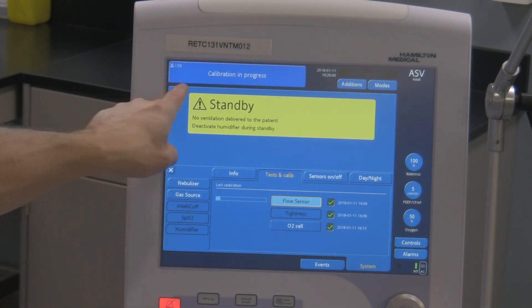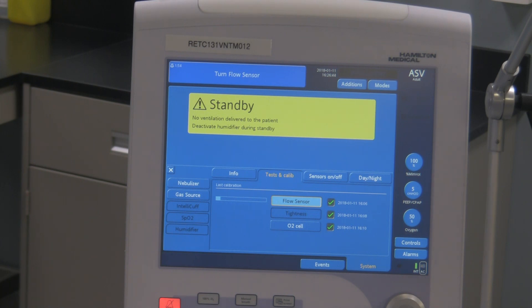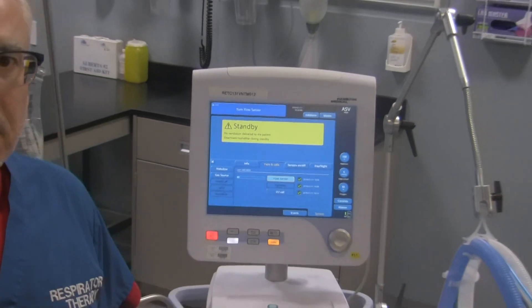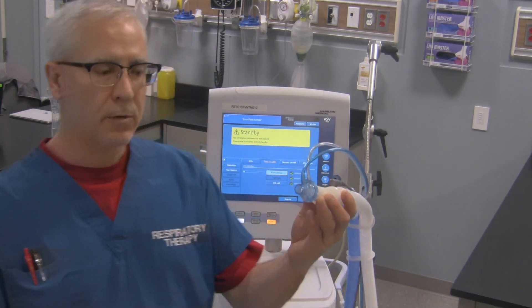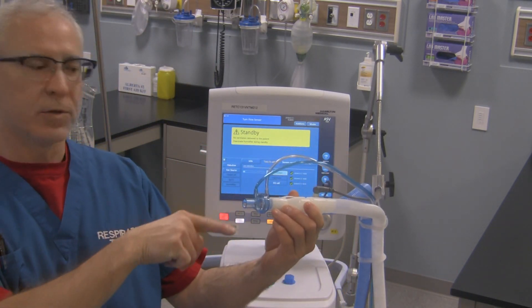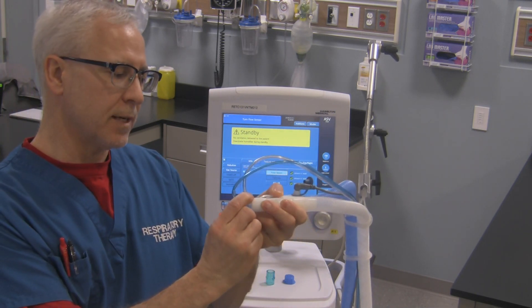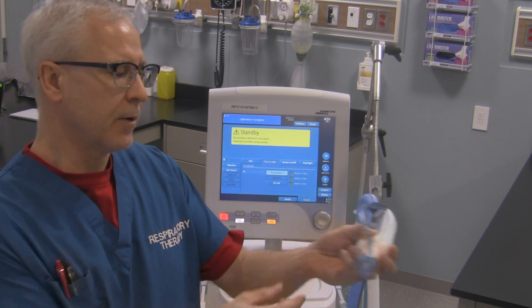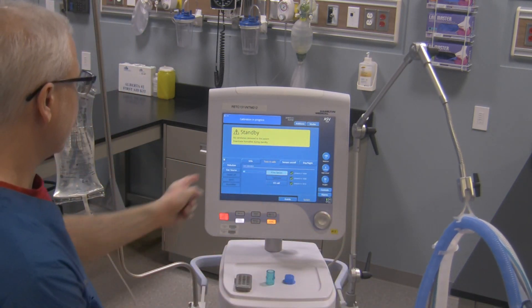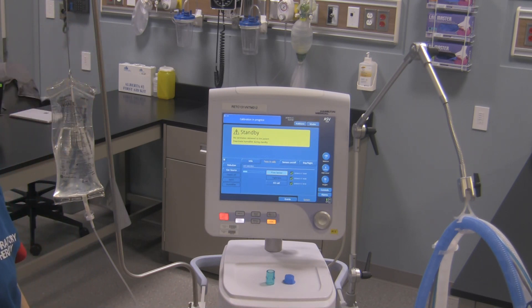We'll hit the flow sensor one. It automatically goes into the test. Up here it says calibration in progress, and then it says turn flow sensor. So what that means is the ventilator wants us to take the flow sensor right over here on the patient Y and simply reverse it. So we'll take this — careful when doing this — we'll take this flow sensor out and turn it like that. The ventilator automatically recognizes it and starts doing more of its test for the flow sensor.